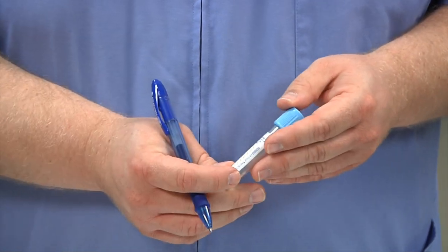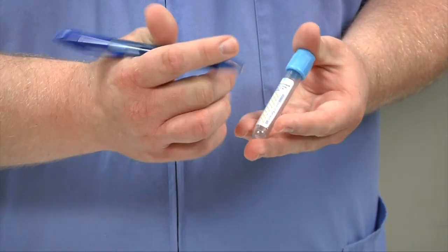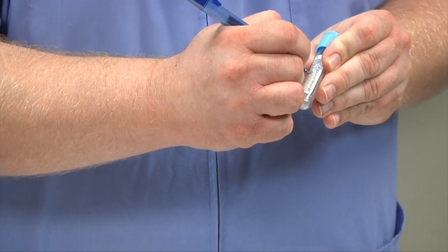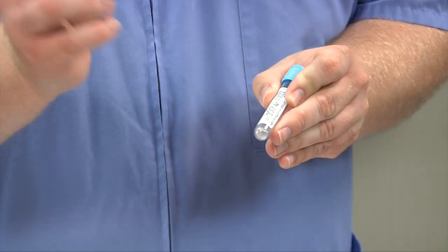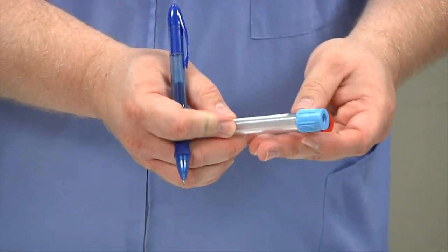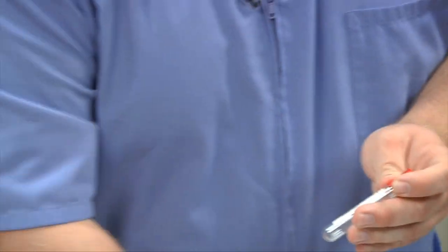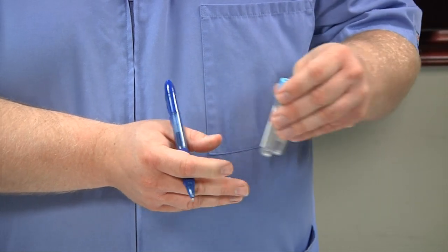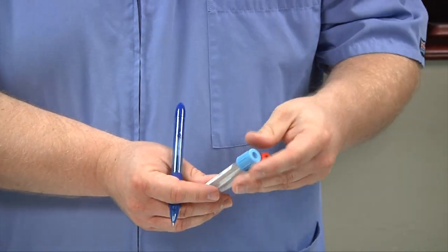After you've bandaged your patient and disposed of all your equipment, and your patient is safe and not bleeding anymore, label your tubes with the patient's name — in this case it would be 'Banana' — along with today's date and your initials. This goes on every tube you draw. Then both tubes go in your lab specimen bag, and you transport them to the laboratory either by the pneumatic tube system or by hand carrying.